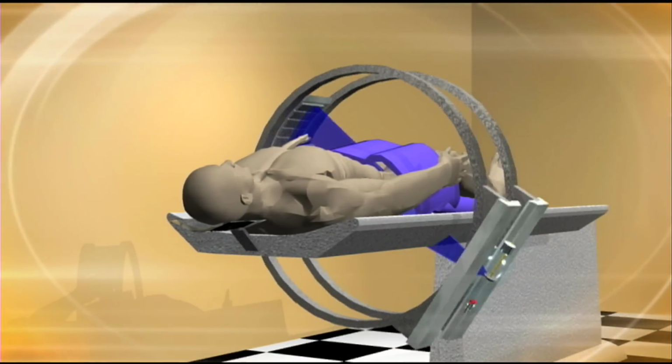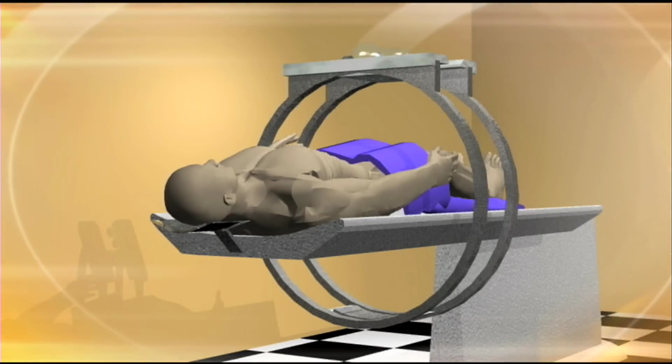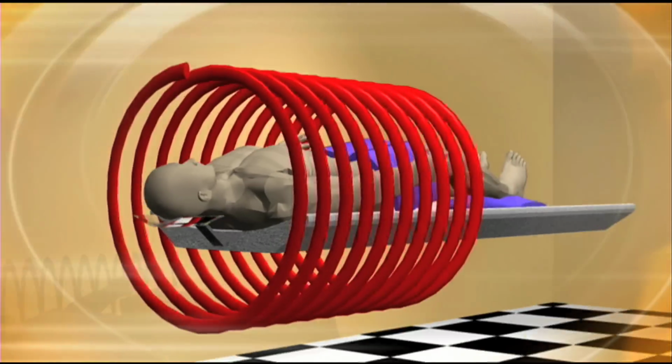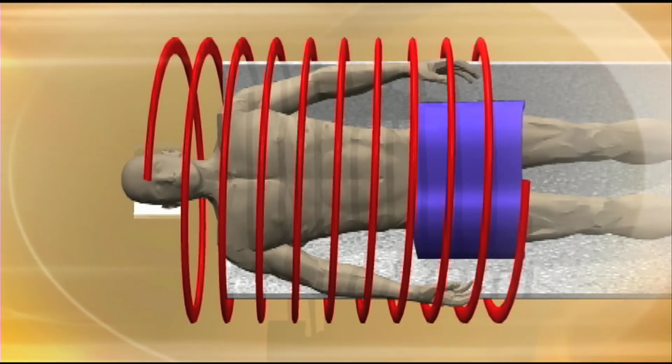And basically, images were obtained almost like a spiral sliced ham. You know how those are sliced around and around and around, and it's a contiguous piece of meat all the way down that bone. Well, that's the way a modern CT scanner works now, is that you constantly move the patient in as the scanner goes around and around.